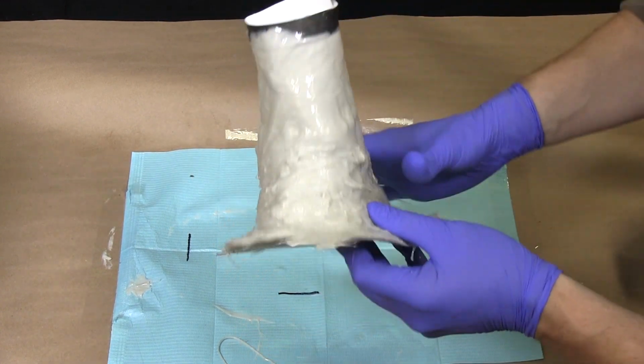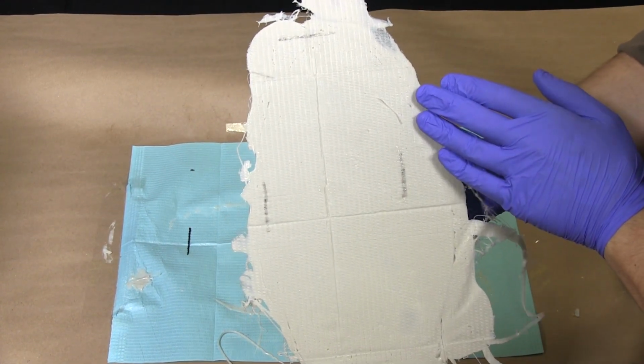Following these steps should result in a full impression with proper pose and appropriate ankle coverage and a thick enough base.